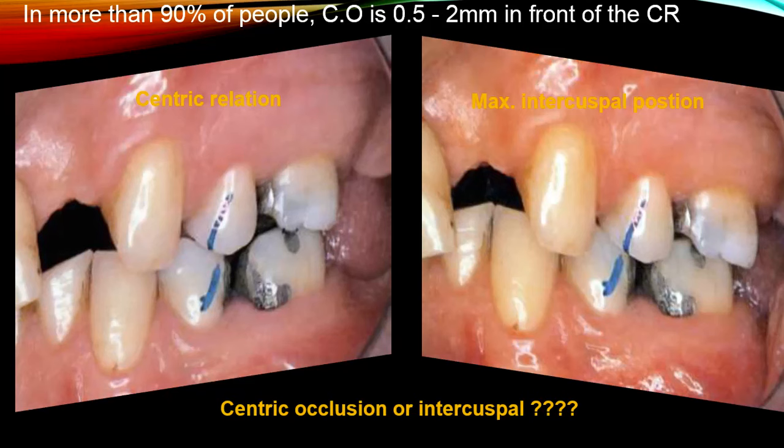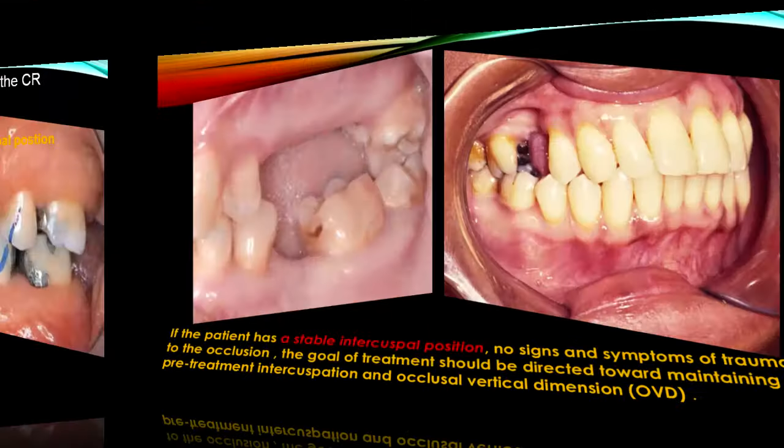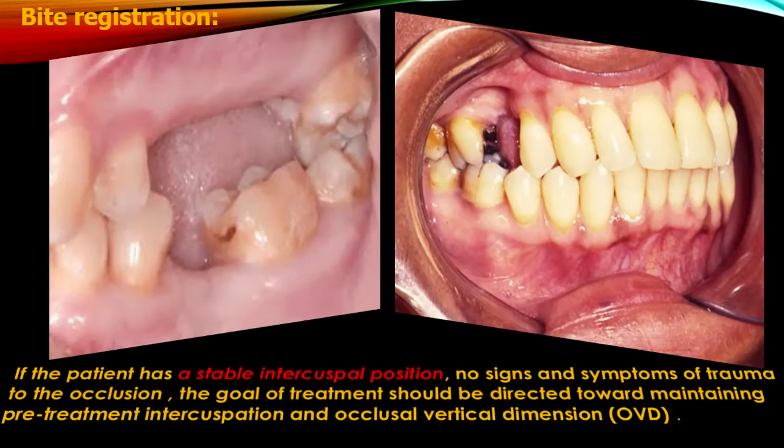طبعا هذه المسألة ليست مسألة اعتبارية، يعني مو واحد بكيفه يشتغل هنا وهنا، لازم اكو حالات معينة نشتغل بيها بالانتركاسبال بوزيشن، واكو حالات معينة نشتغل بيها وين؟ بالسنتريك occlusion or centric relation.